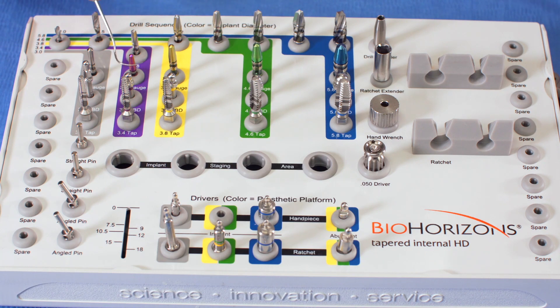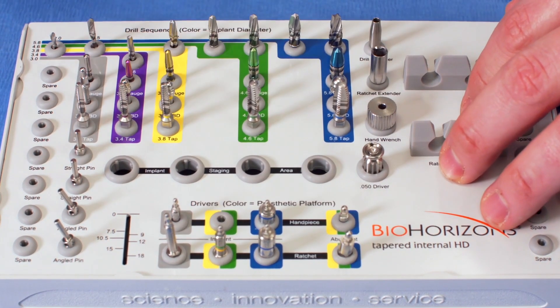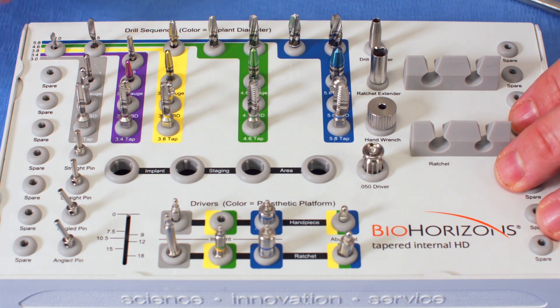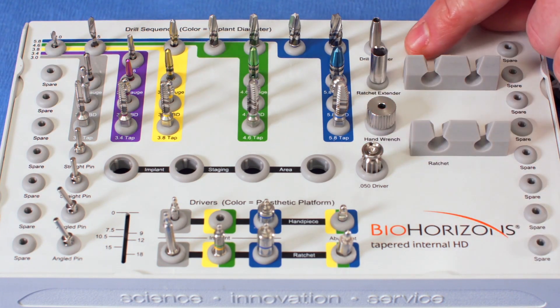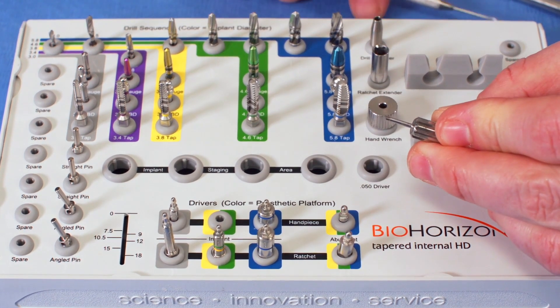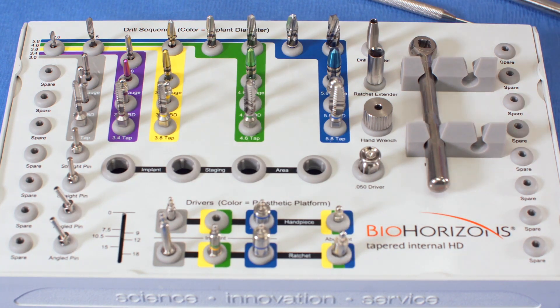In addition to the pilot drills and osteotomy drills, there are also bone crest removal drills so you can remove the crestal bone to achieve a flush implant seat. There are also drill taps — useful for dense mandibular bone where you spiral in the tap and thread it back out. The kit also includes straight paralleling pins to check the angle and depth of your implants with x-rays, and angled pins as well. Within the surgical kit there's also a drill extender, ratchet extender, hand wrench, and a .050 driver for placing your cover screw and prosthetic components, plus a surgical ratchet.